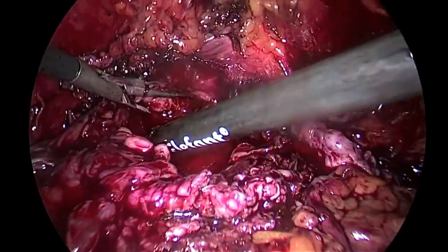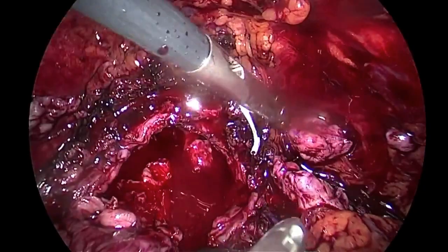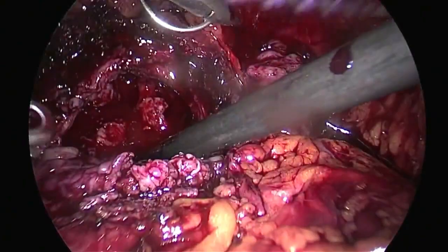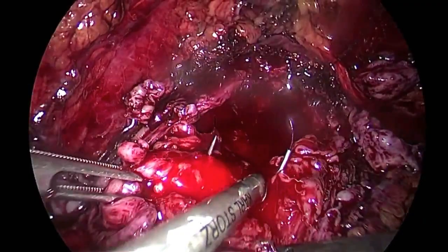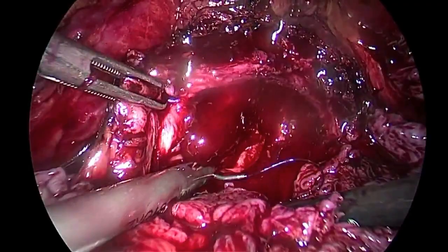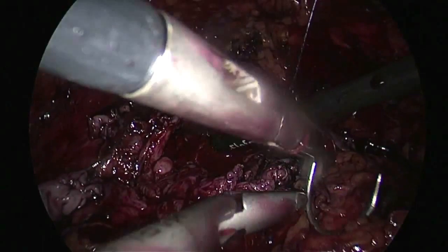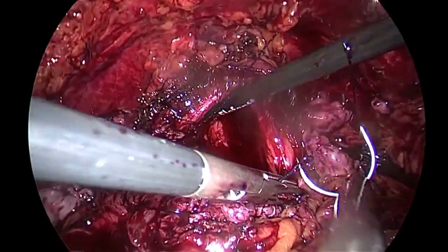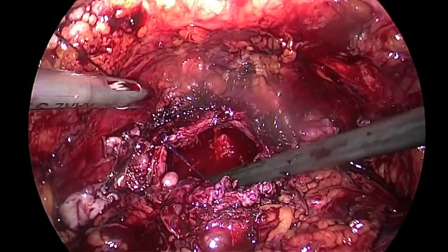And so if in the post-operative state there is a bleeding, for example, I think that is a good idea to perform endoscopic approach, in any case, because in our experience, we control the bleeding in the post-operative stay in one or two cases with endoscopic approach. So in this phase it's important obviously to check that you control the bleeding with the stitch or with the bipolar. Otherwise, the endoscopic approach is very important only if there is a bleeding in the postoperative stay. It's the first step that we advise in case of bleeding. Okay?